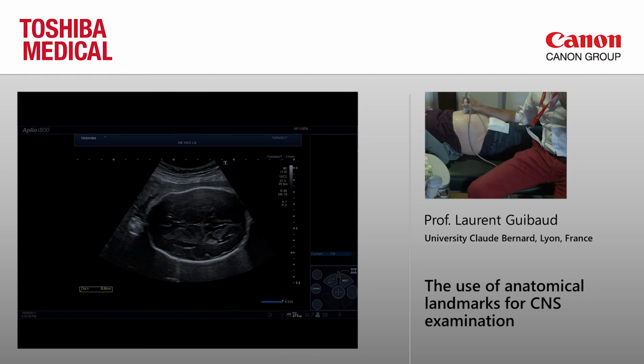The other way of saying that: when you have macrocephaly and a ventricle around 14 millimeters, is it because of obstruction, or is it because it's a benign macrocephaly? So large head, large ventricle, and you are hesitating between obstruction or benign macrocephaly.